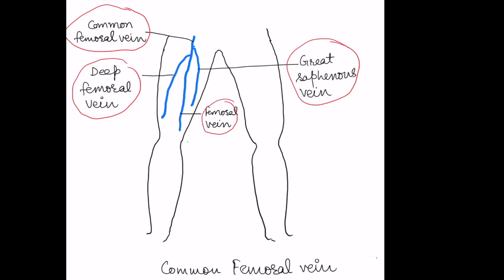For DVT assessment, we perform ultrasound scanning at three levels: first at the level of the inguinal crease, second at the medial aspect of the mid-thigh, and third at the level of the popliteal fossa.